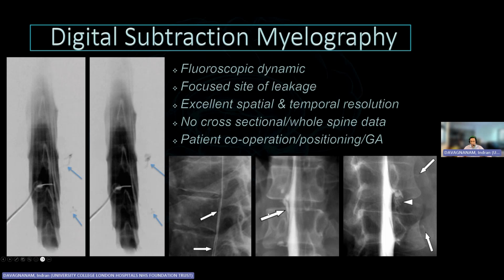But again, we are quite limited, and it happens under general anesthetic. The other downside is, of course, we don't get a cross-sectional depiction of what actually happens. But if we are fortunate, we get to see things in its true projection, and we confirm the diagnosis as such.